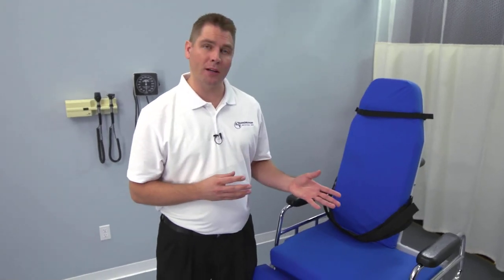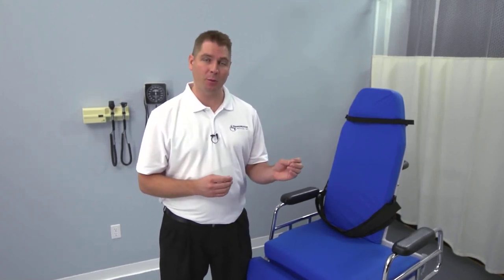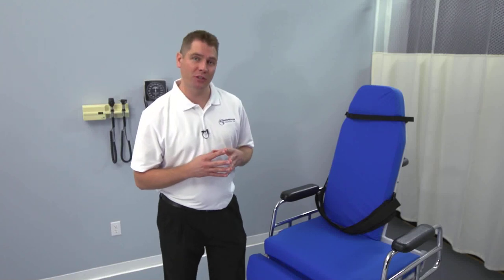Welcome, and thanks for choosing TransMotion Medical's TMM3 Video Fluoroscopy Swallow Study Treatment Chair. In this overview, we're going to take a look at all of the key features of this versatile transport and treatment device. We'll show you how to operate it, and we'll demonstrate how it streamlines the swallow study procedure.